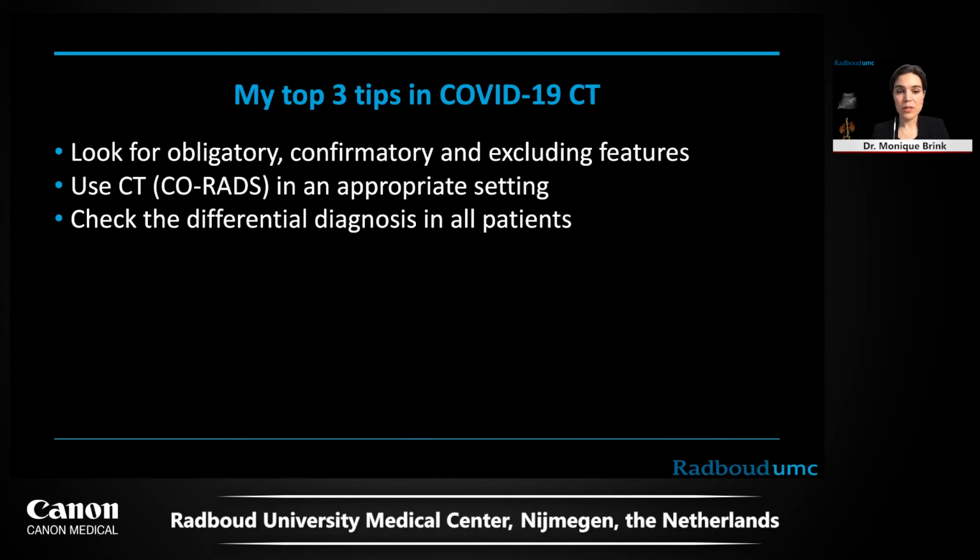Look for the obligatory, confirmatory, and excluding patterns. Use CO-RADS or CT in an appropriate setting and check the differential diagnosis in all patients. Thank you very much for the attention.